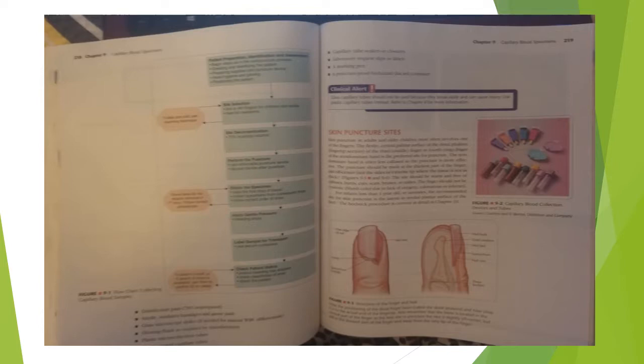For infants less than 1 year old or neonates, the recommended site for skin puncture is the lateral or medial plantar surface of the heel. The heel stick procedure is covered in detail in Chapter 10.